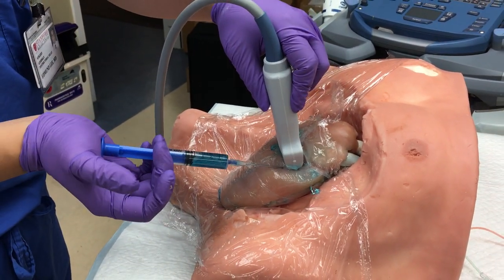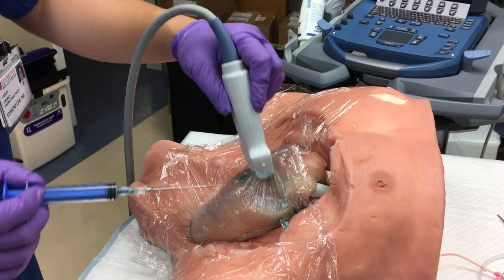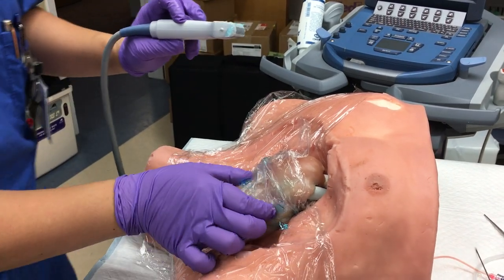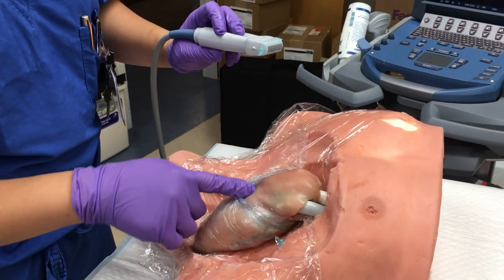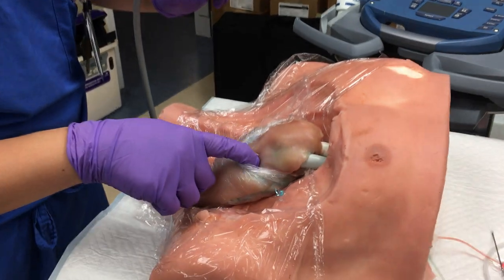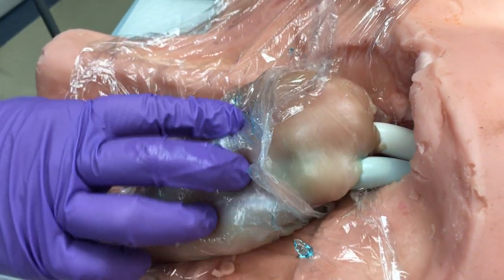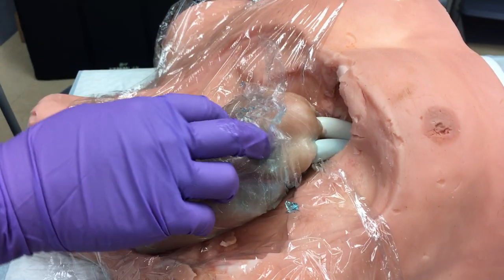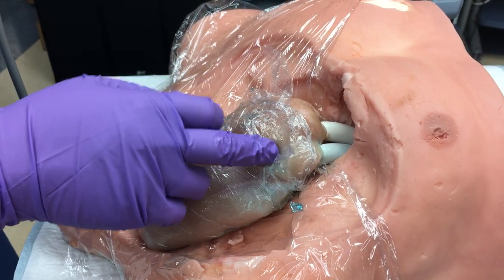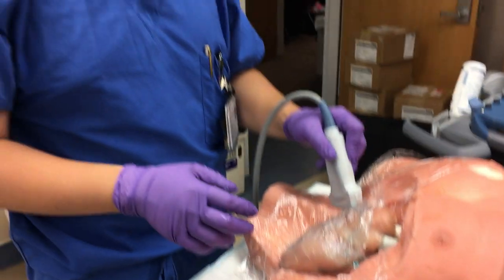The other advantage of this — let me just push this back in — once I pull out, this model can be reused. There's not a significant amount of leaking, and no significant trauma onto the breast, so it could be reused. If there's a large enough skin area, you can replace the chicken breast. There's some leaking from the tubing when put under intense pressure, but overall we did six needle punctures on this one piece of tubing on the vein and it's still good. This is the chicken MoVat central line model.